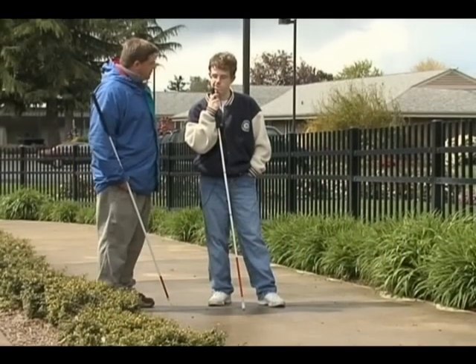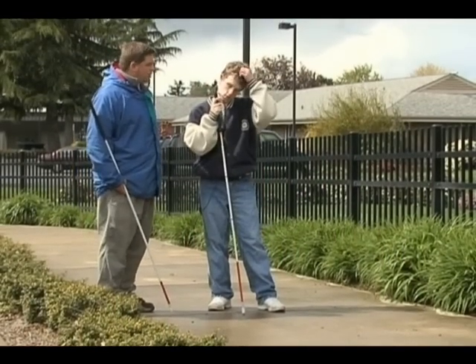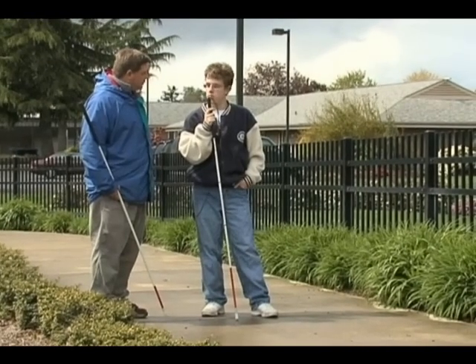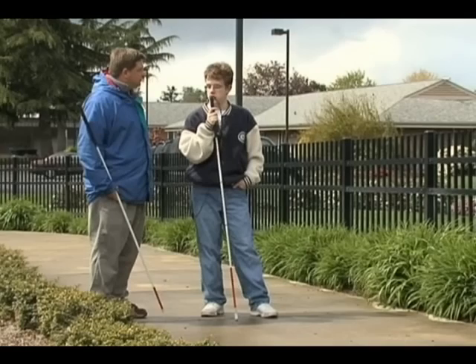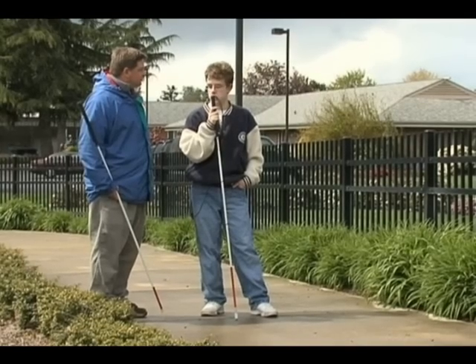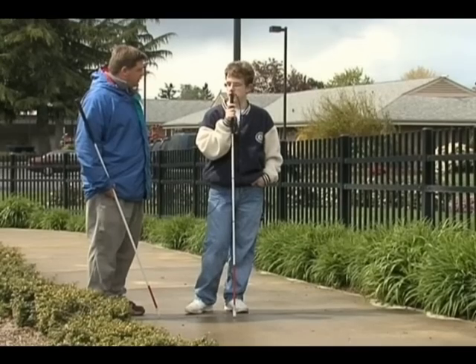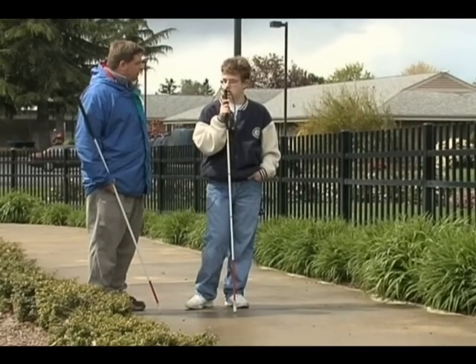Hey Tyler, today I would like you to show us how constant contact is useful on a sidewalk. What would you use it for when you're outside walking? You would basically use it to determine a texture change. So you might be looking for a sidewalk where a texture might change — it could be smoother or it could get rougher.